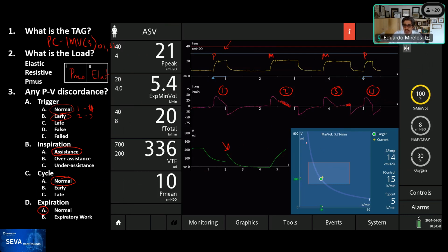Yeah, and they do set longer inspiratory time, but if the patient is passive, that really doesn't affect us, right? But if the patient is awake, there may be a facilitation of having poor interactions when you have a longer inspiratory time, especially when the patients are in transition. But now you can see. Go ahead, Rob.